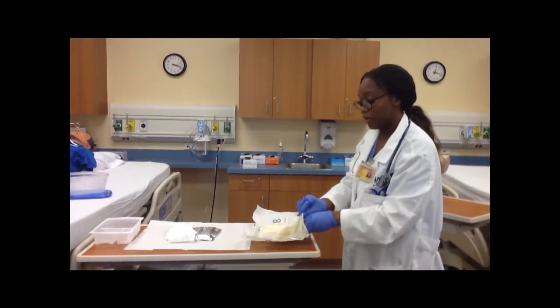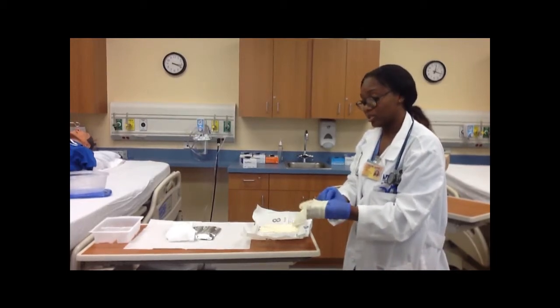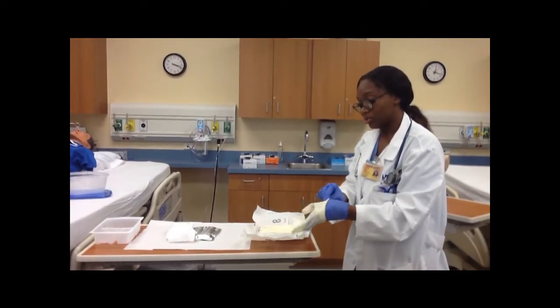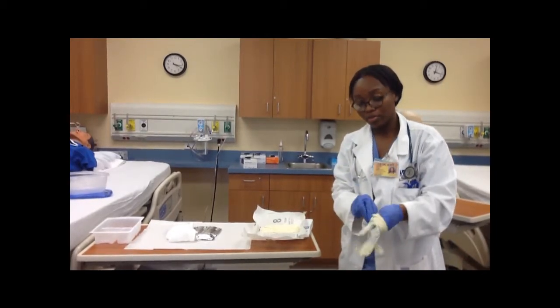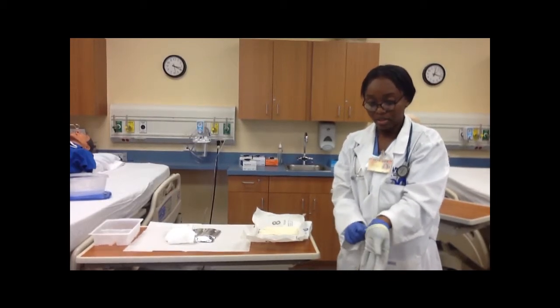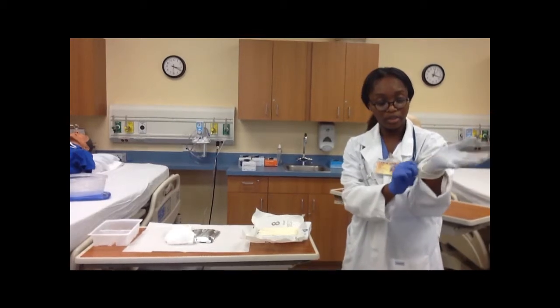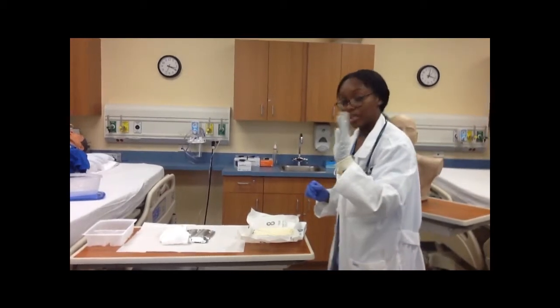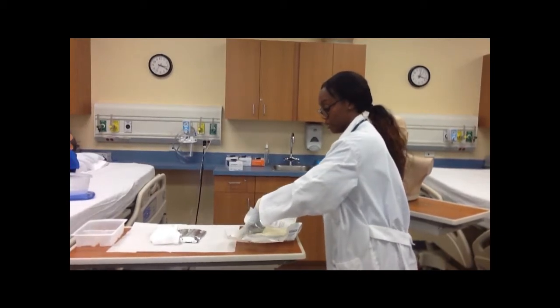With the gloves, you can handle it on this side, making sure not to touch the sterile portion. Right now, I'm just dressing my non-dominant hand with my dominant hand, making sure not to touch the sterile portion of it. And with this glove, sterile can touch sterile, so I will go from underneath the cuff.